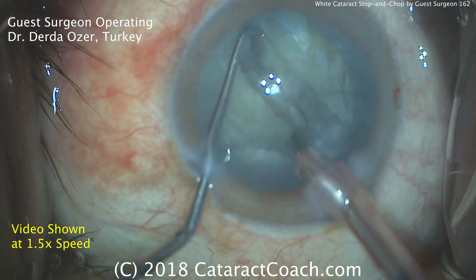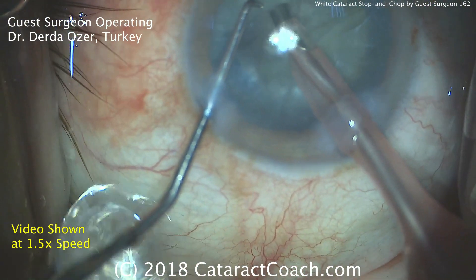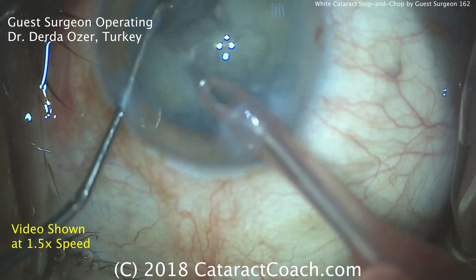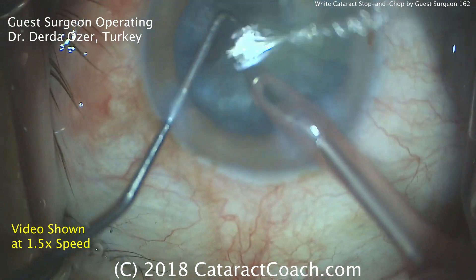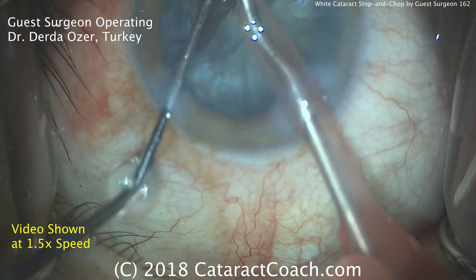Now buzzing into the first half; the chopper goes around the equator. Beautiful, nice chop — that first heminucleus has been chopped into two halves. These halves can now be emulsified quite easily with the phaco probe. It looks like a bent Kelman tip on the phaco probe, which looks good. The pink sleeve is the smaller bore.